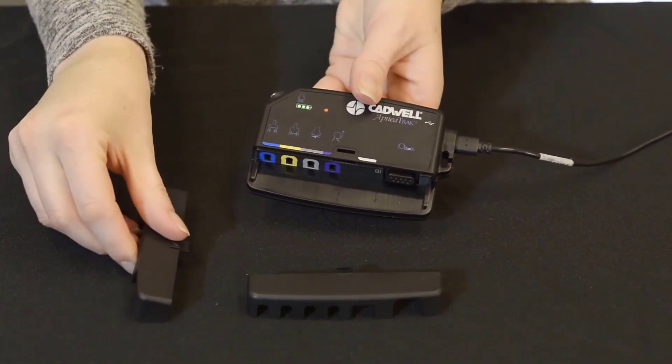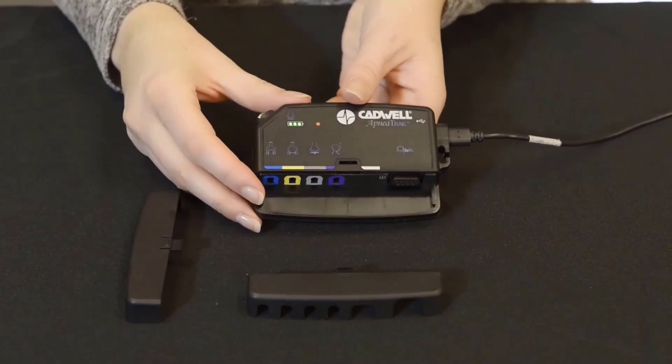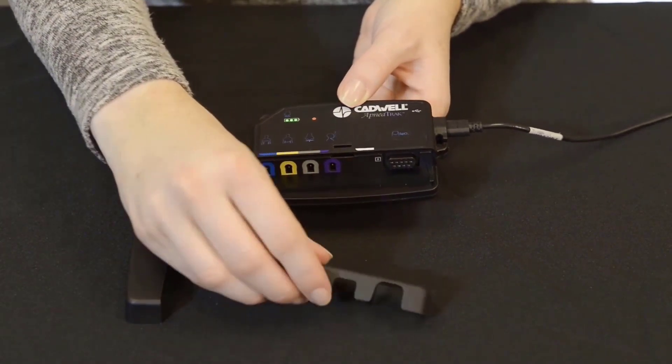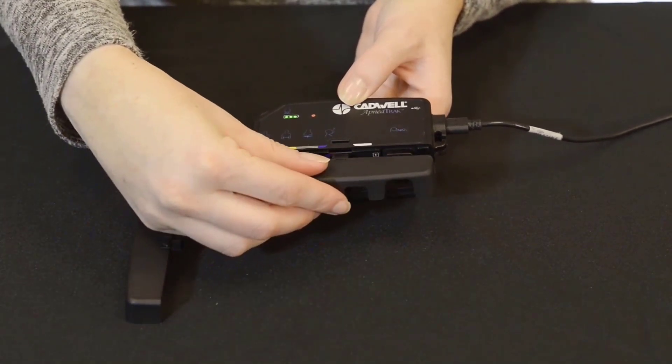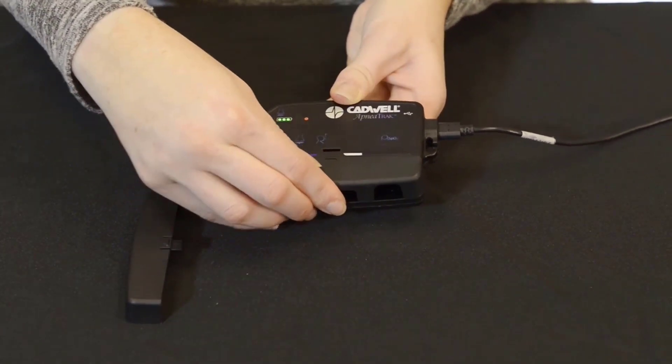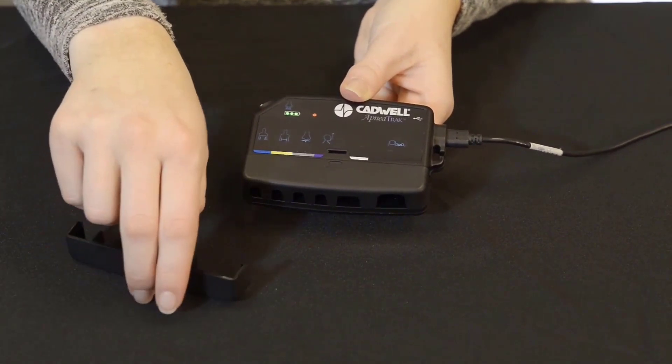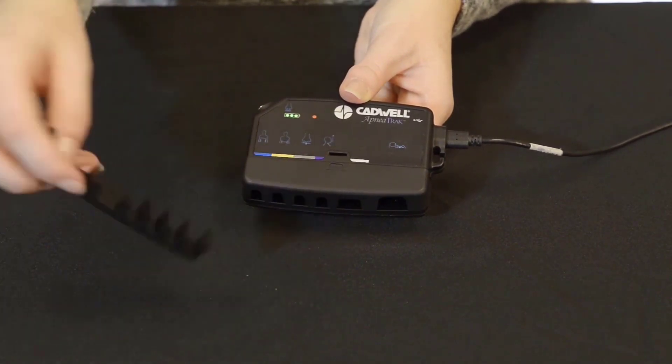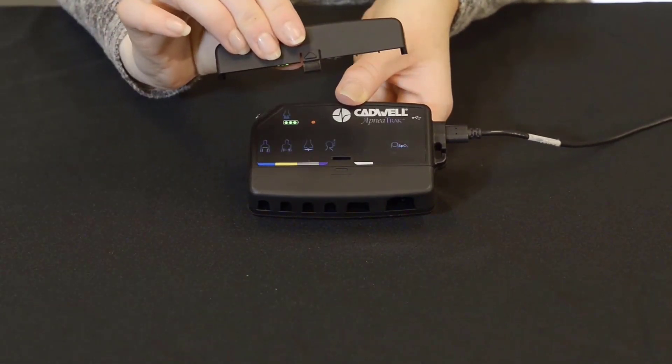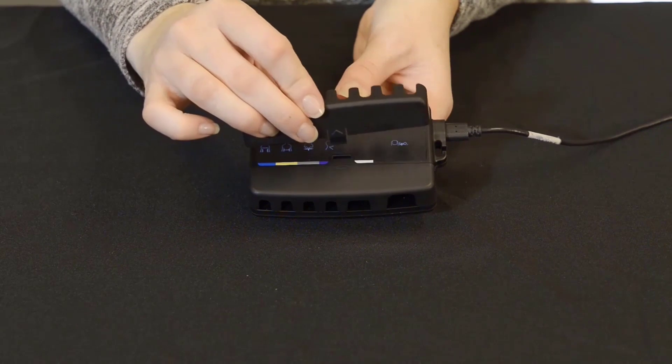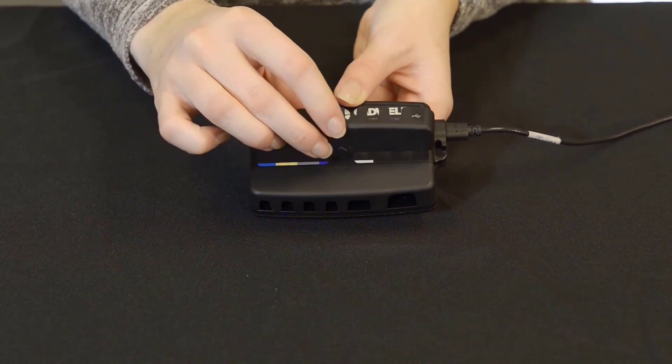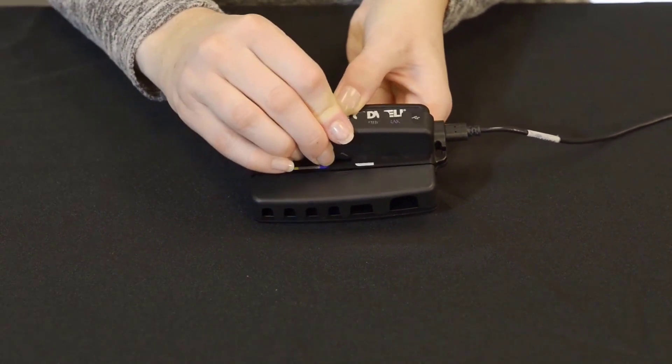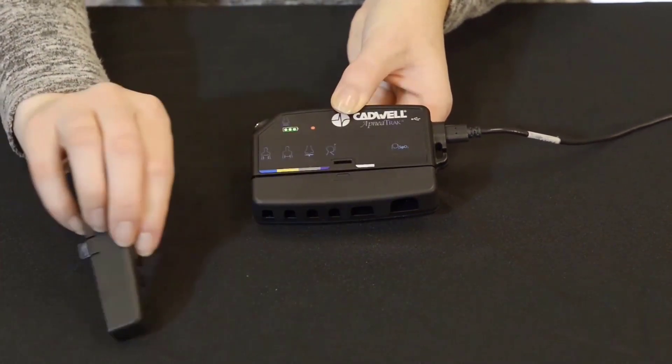The second is a locking cover and is difficult to remove by hand, but discourages patients from altering connections to the device when taking it home. To eject the locking cover, use the removable cover and press the tab into the slot on the front of the ApneaTrak.